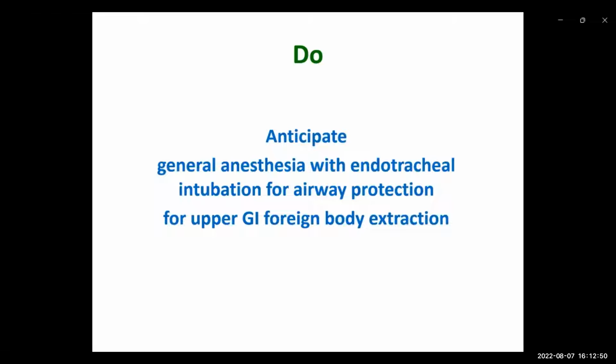It is an ESGE recommendation that any patient with hematemesis, agitation, or encephalopathy should have general anesthesia with endotracheal intubation prior to endoscopy for upper GI bleeding.